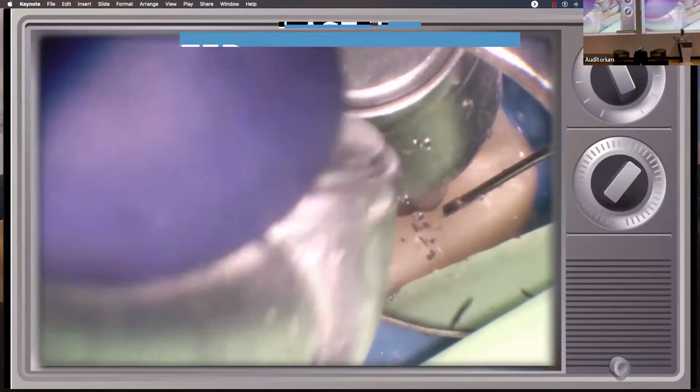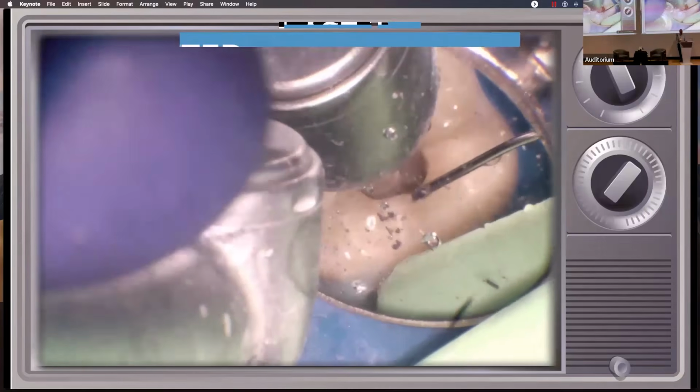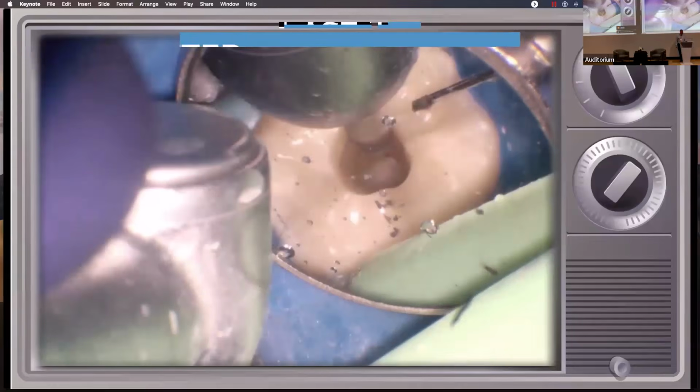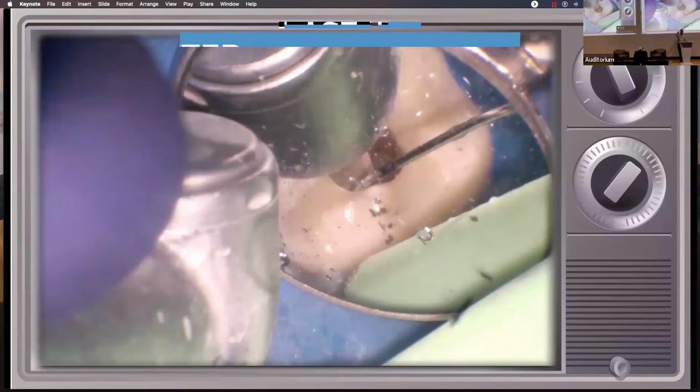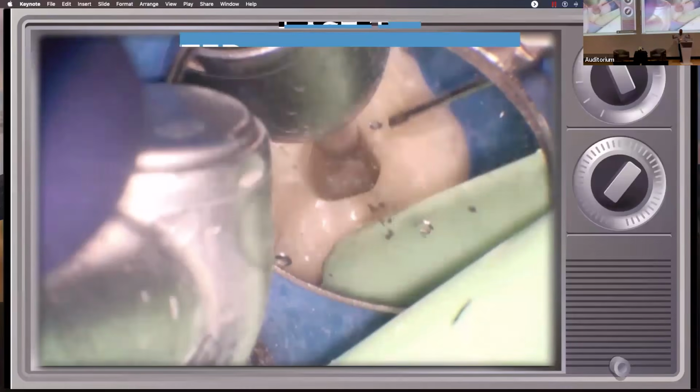Chairside is in there with the Stropko irrigator, watching where I'm cutting and keeping everything cool and keeping the diamond clear. And I'm only down just to the level of the dentin. We're not going down yet, we're going out.